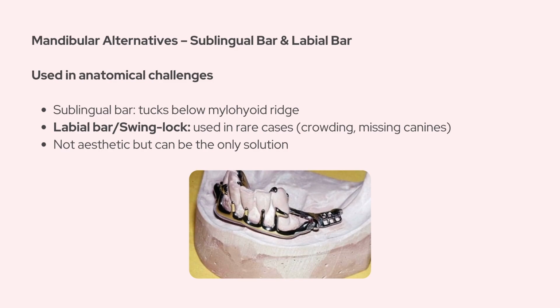And that, in a nutshell, covers the major connector designs for both arches. So just remember, the connector isn't just some passive bridge between components. It's the structural core that determines how stresses are distributed, how the denture functions, and ultimately how your patient feels while wearing it.